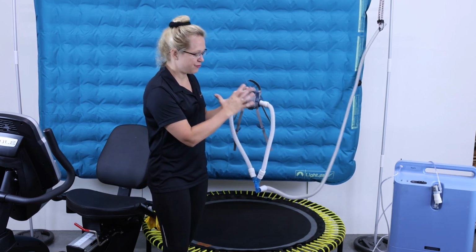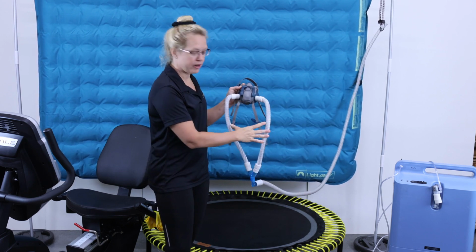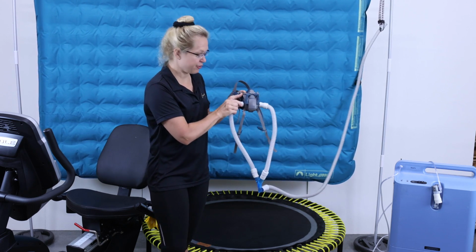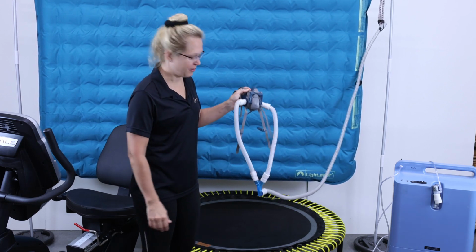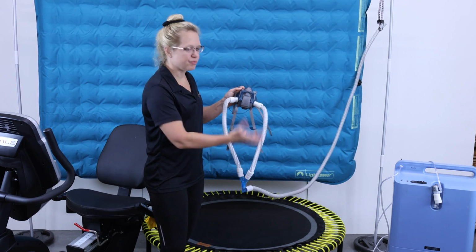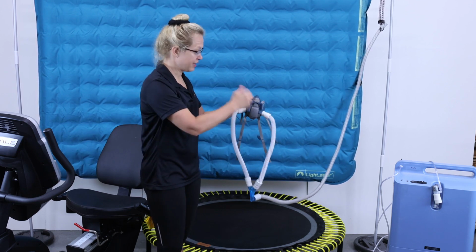So this one is fantastic. If you're gonna really exercise hard, then you're gonna want a dual hose mask, and you could make one for $30. This was $30. Or you can buy one for $260. It's up to you. But this allows you to breathe more volume if you're going to be exercising hard. So that's why you want two hoses.